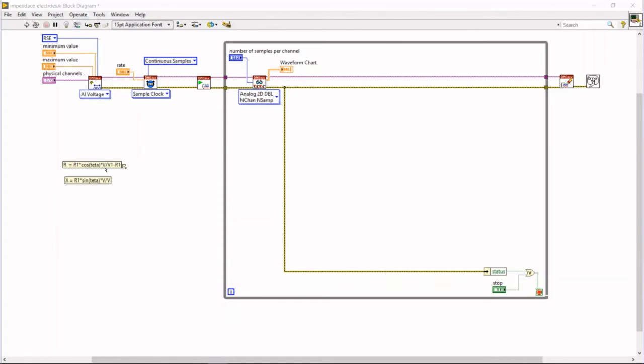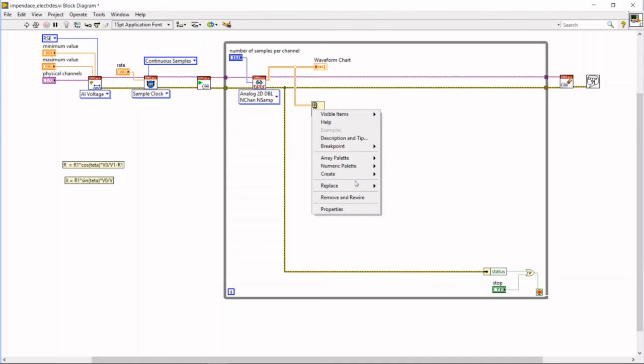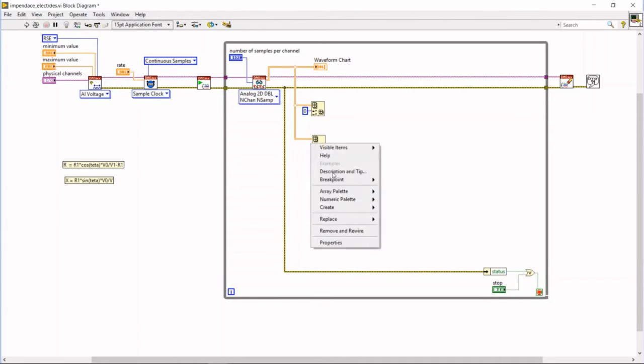Because we need both V0 and V1, I'm going to need both of those signals here, not the joint one. So I'm going to use the index array function to collect that data, and this is V0, that is on the first row of the data. I'm going to use the same function, only I'm going to select the data from the second row. Okay, now we have VA and VB as our outputs.